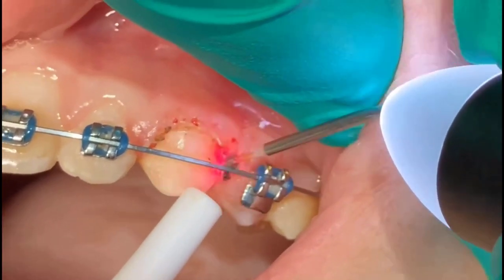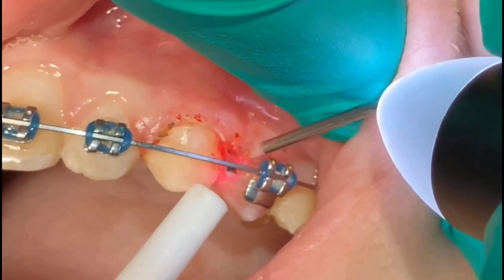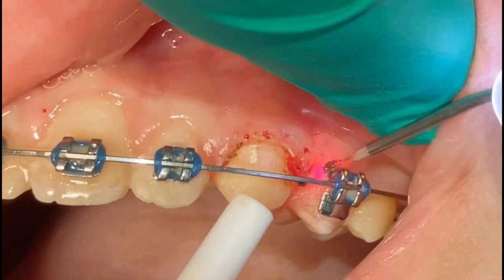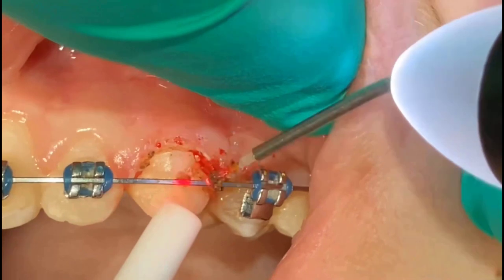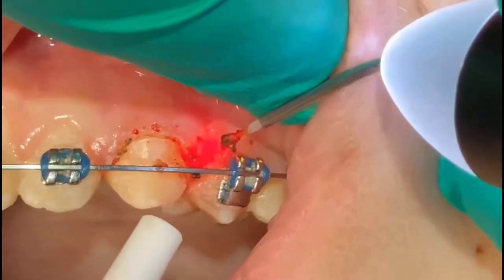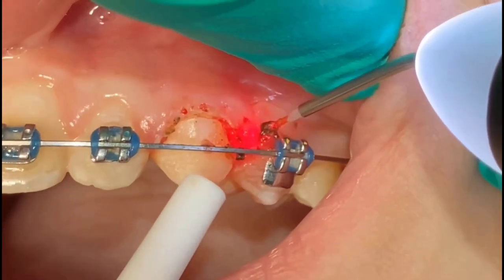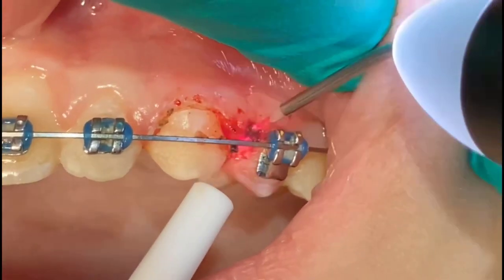Hygiene. The thing is, once you start here, you just go and go and go. Two other things to point out. When the diode cuts, it's heat. You get a bactericidal effect on the remaining tissue as well, or a biostimulation effect on the tissue. That's very, very important. And just cleaning up around these brackets is going to make the area much healthier for this type of thing.